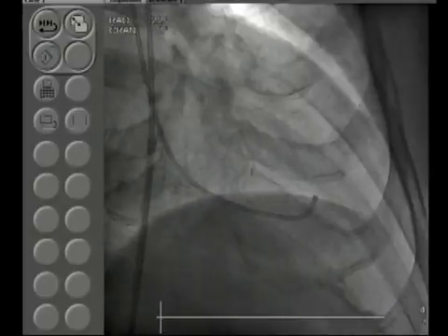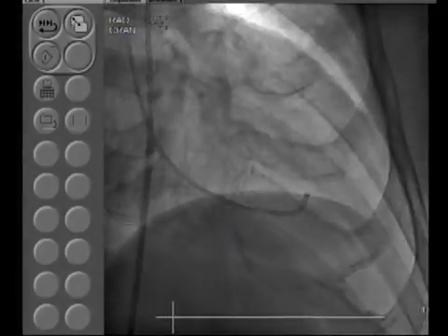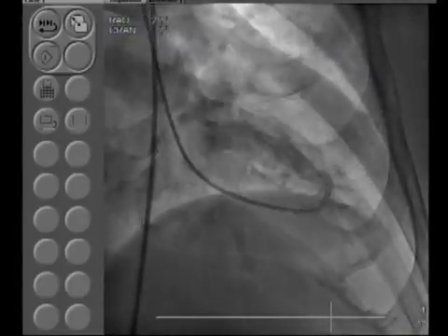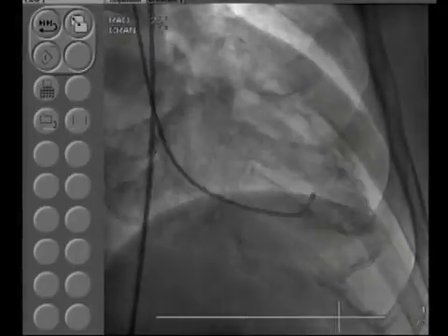But another technique which we are using at Sinai is micropuncture. If you see it's unfavorable, then you take it out, press it for 3-4 minutes, and then repuncture at the ideal location. Okay. And this is the LV function. He had an EDP of about 12.